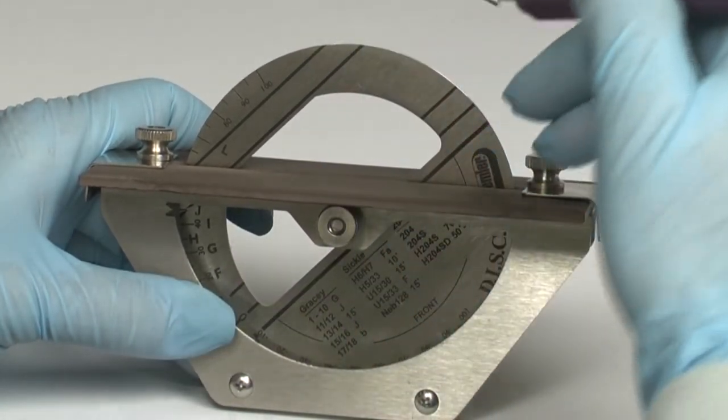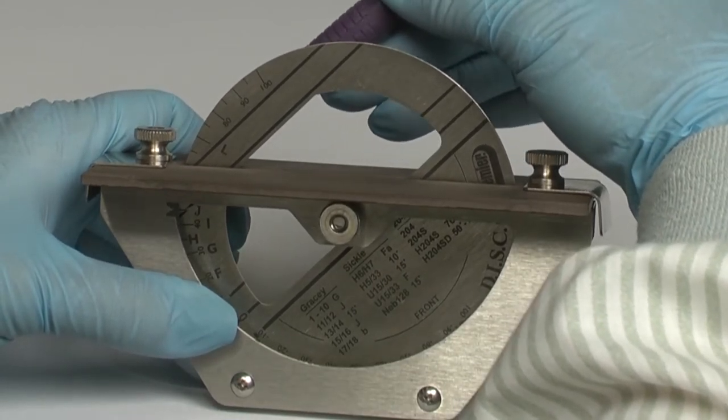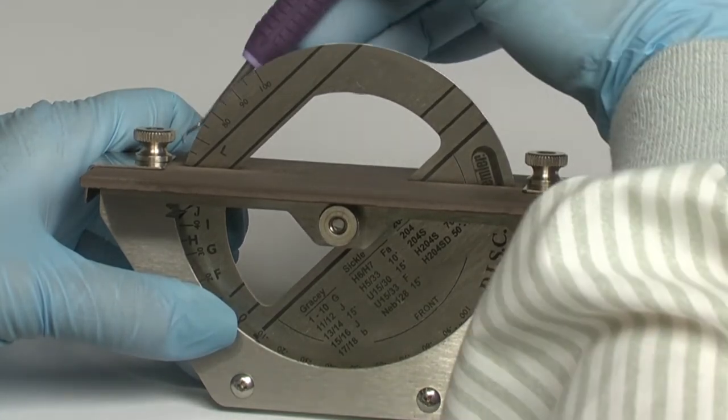Now flip the instrument and position the cutting edge on the rear stone with the toe positioned towards the wheel. The handle is aligned with the bold reference lines and repeat the same sharpening step.